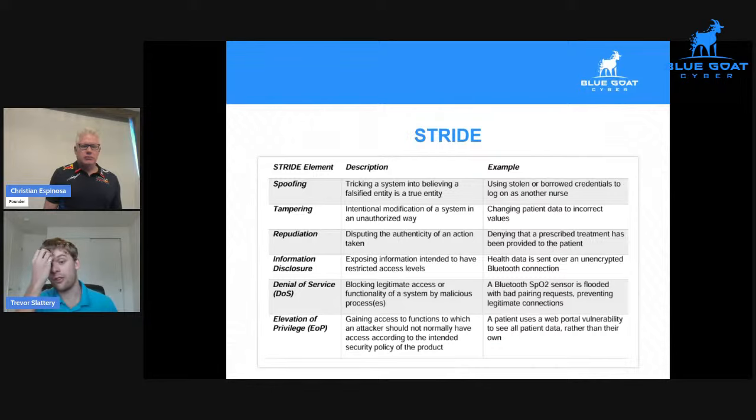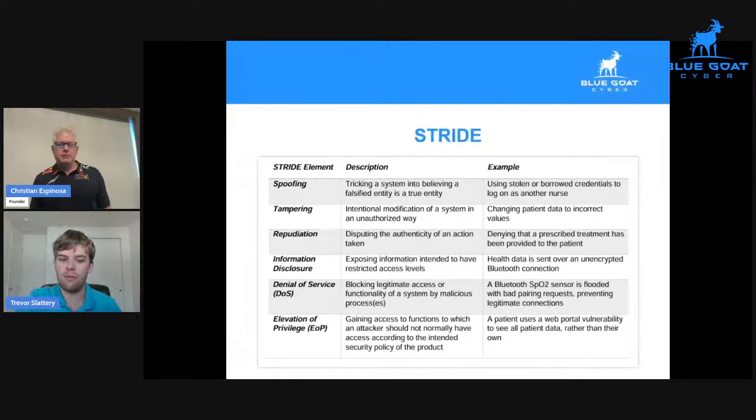Denial of service is also a very important issue with medical devices, especially with a device that can potentially provide life-saving treatment in a very short amount of time. If it's not operational, that can be a pretty big problem. A good example of that is an IVD system. That in vitro diagnostics takes some sort of tissue or sample of a person, and it makes a diagnosis on it. So if someone has sepsis and the device is down or goes down, and we don't actually say they have sepsis, their blood is toxic and they could end up dying.